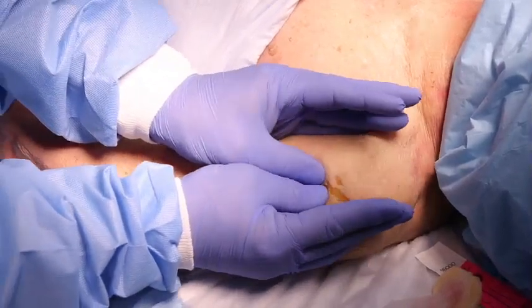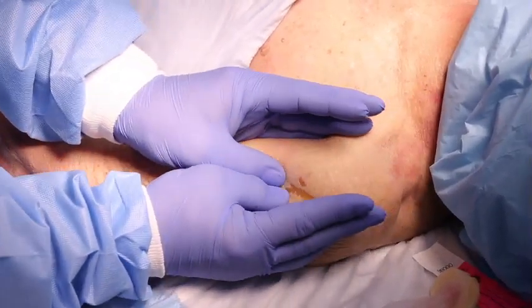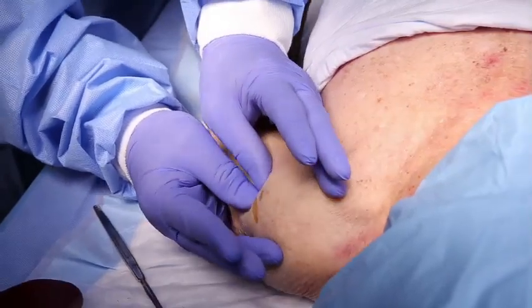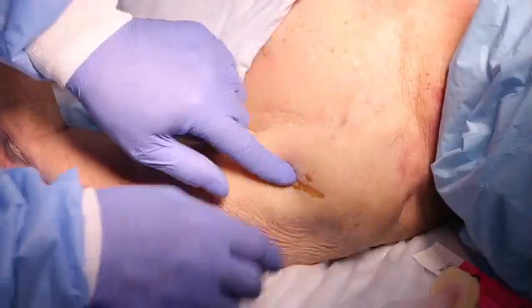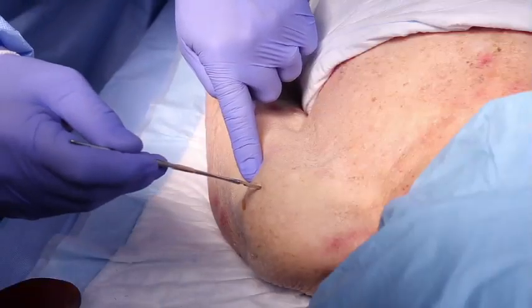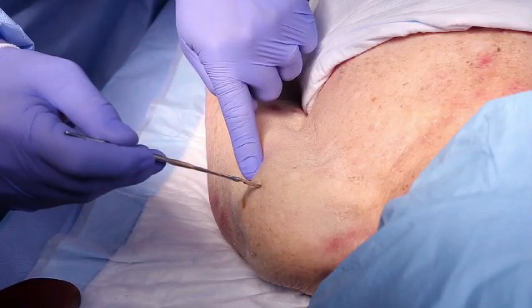Palpate deeply as you climb up the humerus to the surgical neck. It will feel like a golf ball on a tee. The spot where the ball meets the tee is the surgical neck. The insertion site is on the most prominent aspect of the greater tubercle, 1-2 cm above the surgical neck.